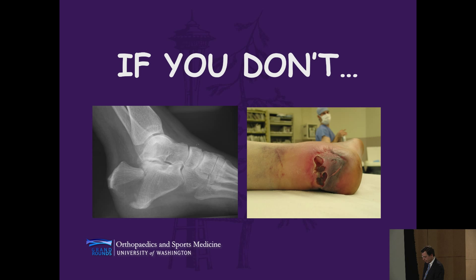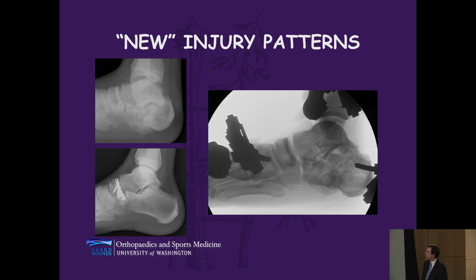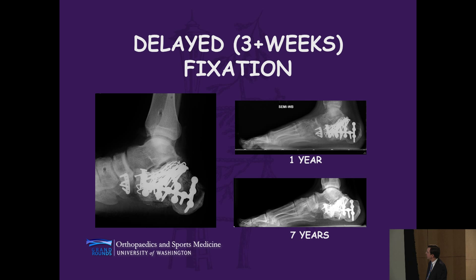We have new injury patterns that really defy description. You can't even classify them. This is an example of what you see in a head-on collision on the freeway. This is a right foot that was broken by the impact, and the left foot was also broken, but this is just by way of an examination of the shape of the normal foot compared to the injured foot. We literally just tried to reestablish the morphology with this frame. The reconstruction here was done about 3.5 weeks later. We saw him at a year and at 7 years, and it's not perfect, but he manages to walk and he doesn't have any pain, so we've accomplished what we set out to do.